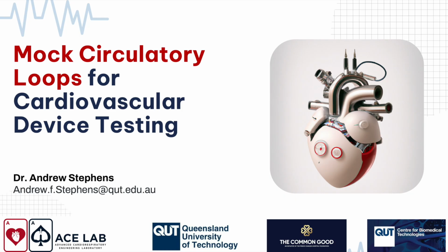So that's quite nice. In this one on the bottom right corner, we can see that there's a linear stage that actually pistons back and forth, and that pushes fluid into and out of that box with the ventricle in it. And the ventricle will be some sort of silicon system whereby as the water pressure increases inside the box, it actually squeezes that heart and causes it to eject.